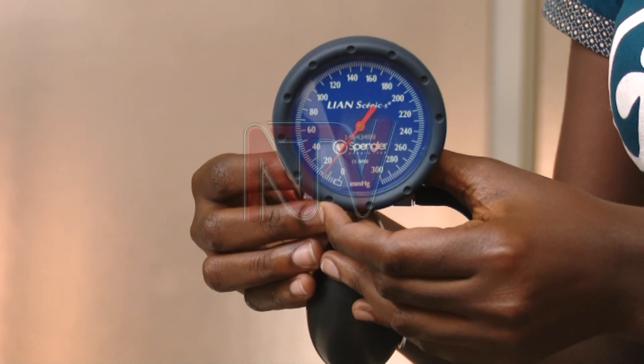According to the team, the device has already been tested by the Uganda National Bureau of Standards, which found that the components — such as the gauge, casing, and other parts — meet the required standard. What remains is the clinical trial, after which they will determine the margin of error and whether the device works properly within international standards.